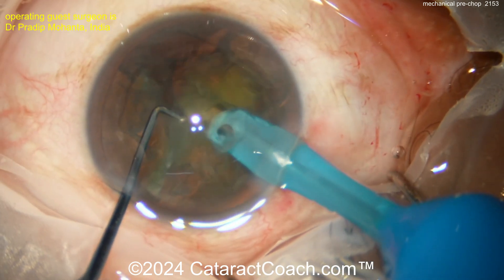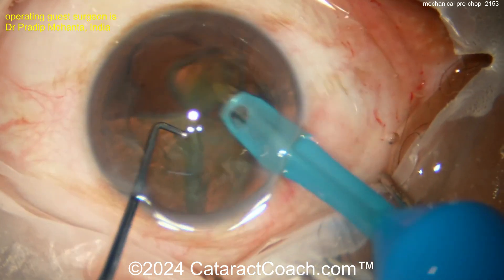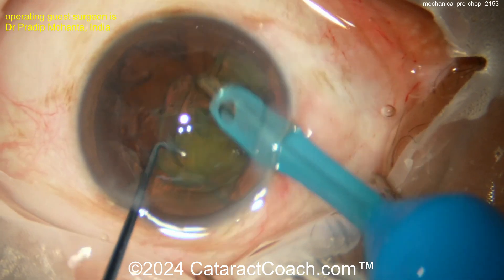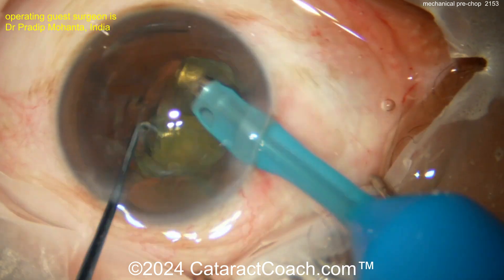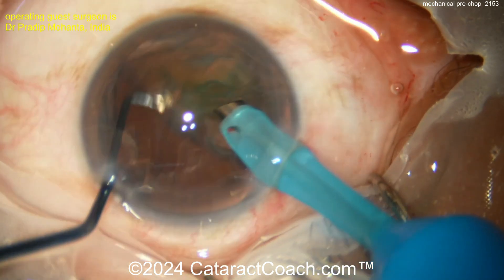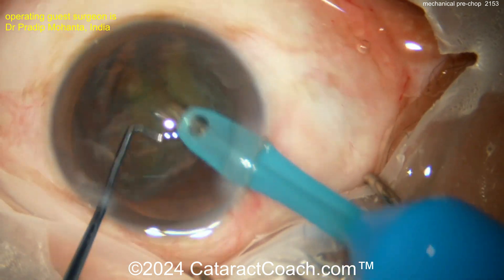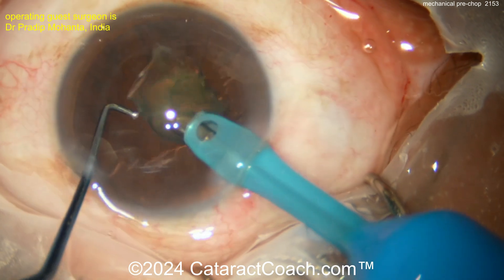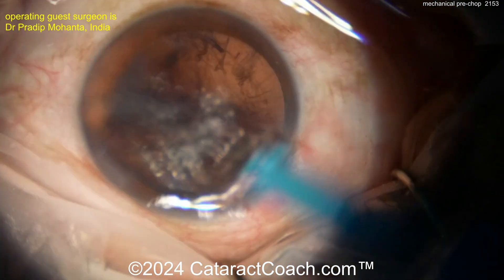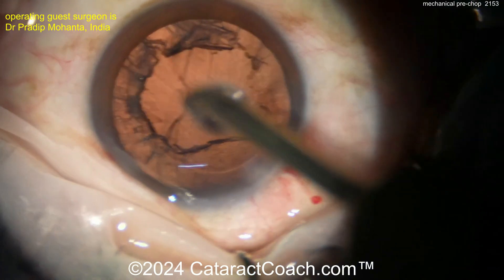Because it's not using phaco vacuum to hold the nucleus, there's really no time constraint. With traditional chop, when holding the nucleus with phaco vacuum power, you have a very small window of one or two seconds to accomplish the chop. Here there's no such window — no rush, you can take your time. The key is instrument placement: the chopper just sub-incisionally inside the capsulorhexis, and the sustainer 180 degrees opposite around the lens equator. Then bring them together and pull apart to achieve the split.